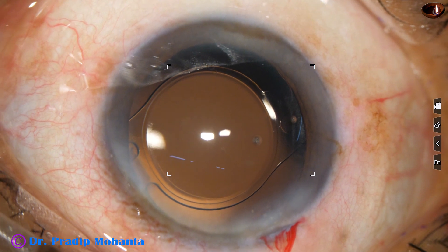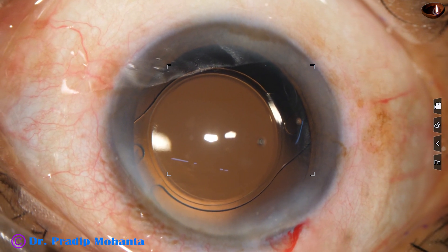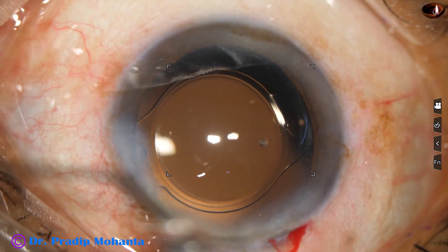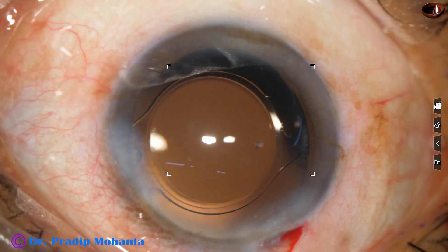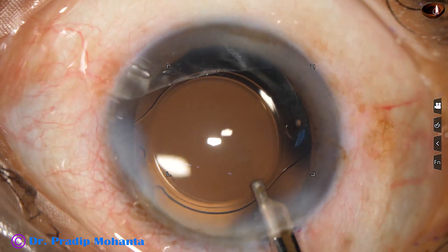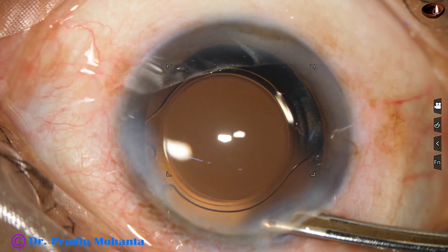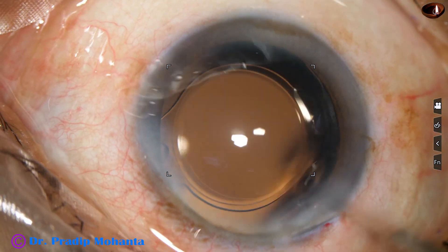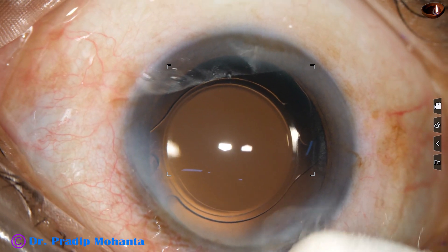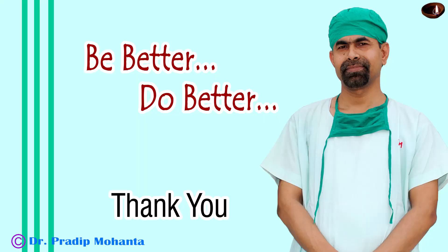The surgery is now done. You just have to close the side port by stromal hydration. Moxifloxacin has been injected into the anterior chamber, and this is our final lavage of the anterior chamber. The anterior chamber is nicely formed and the case is concluded. The integrity of all wounds is checked, and few drops of Moxifloxacin are applied over the cornea.